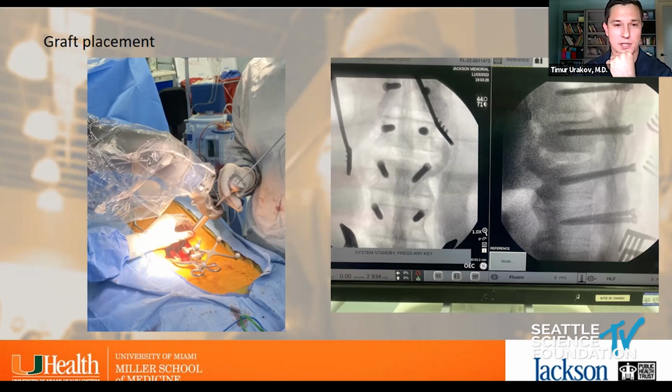Of course, this is a deviation from the norm, right? This is not a straight line pedicle orientation for the robotic system. There's still a lot of instruments that need to be further adjusted and developed to make this step a little more, I would say, higher quality. But at least it's a beginning. We're able to navigate, putting those lines in the non-traditional, non-pedicle orientation.